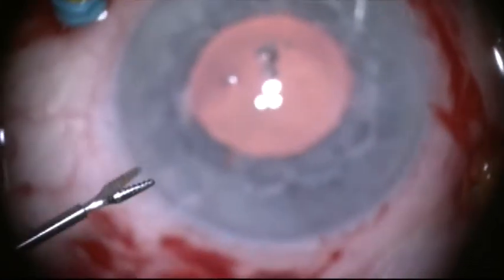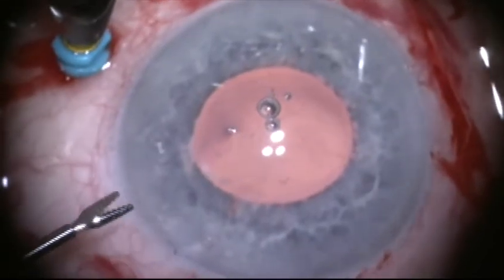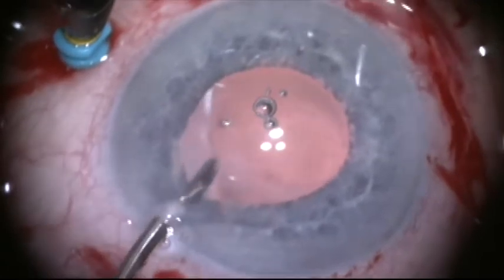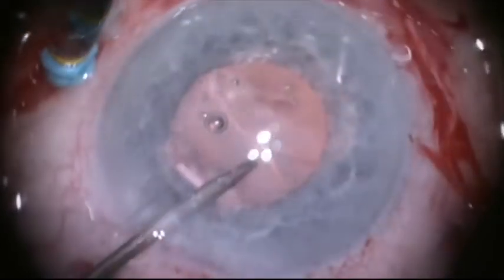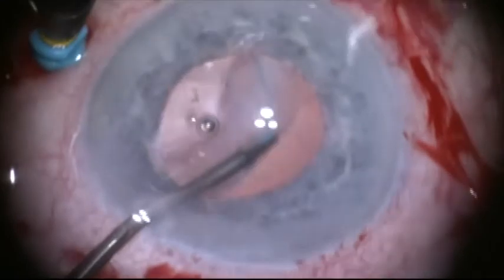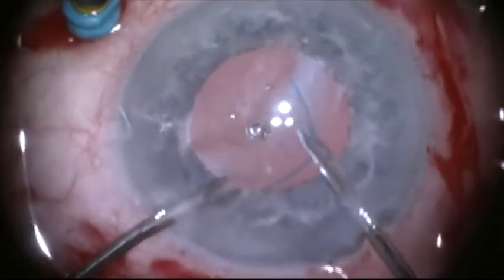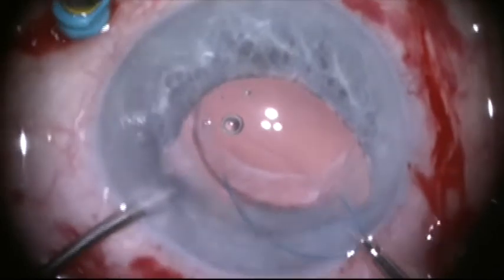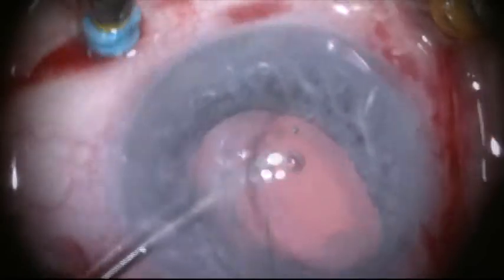While I'm holding the haptic with my right hand using the maxi-grip forceps through the pars plana trocar, I'm now going to enter through the paracentesis with an MST micro holder and hand that haptic to my left hand so that I can secure it. Bear in mind that the view seen through the Biome system in the video is reversed, so I was using the opposite hands of what it appeared. I'm now going to hand the haptic to my right hand using the maxi-grip forceps placed through the clear cornea incision I pre-placed.